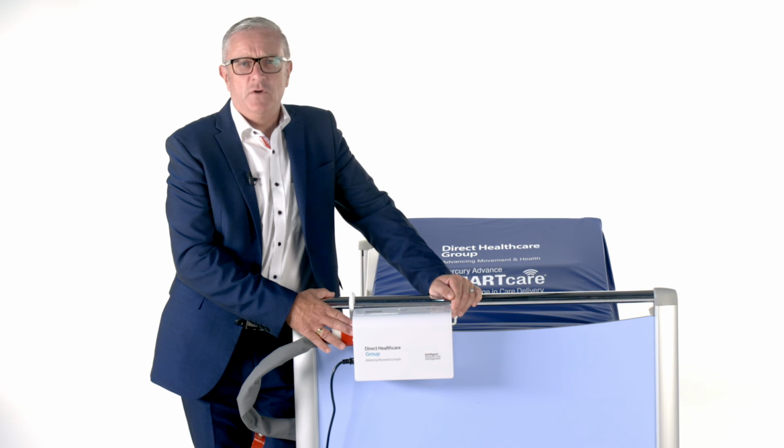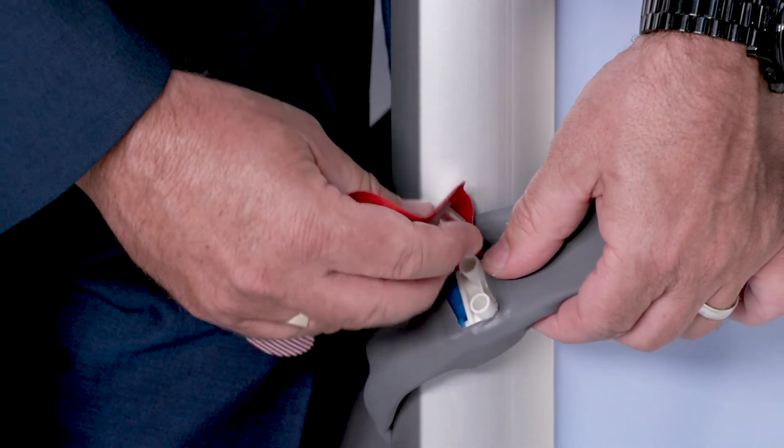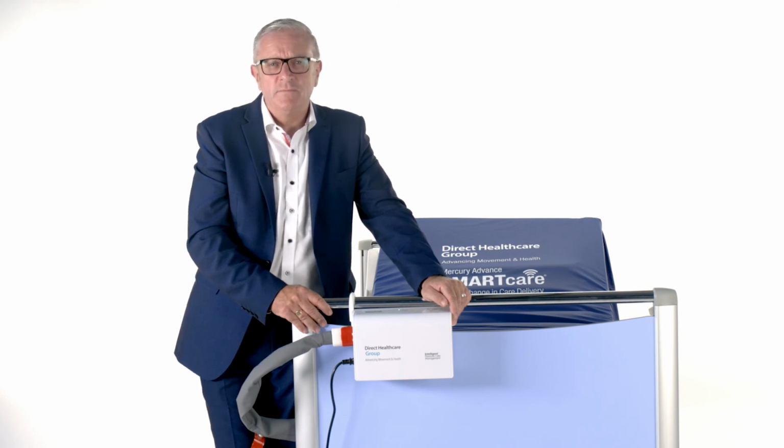If a low pressure fault should occur, there will be an audible warning and the letter B will illuminate. The most common cause for a low pressure alarm is an escape of air at the CPR tag. Please check the CPR tag is firmly in place, sealing the two holes and therefore preventing air from escaping. If this doesn't rectify the fault, it could be the main connector to the pump. Please make sure this is connected to the pump properly.